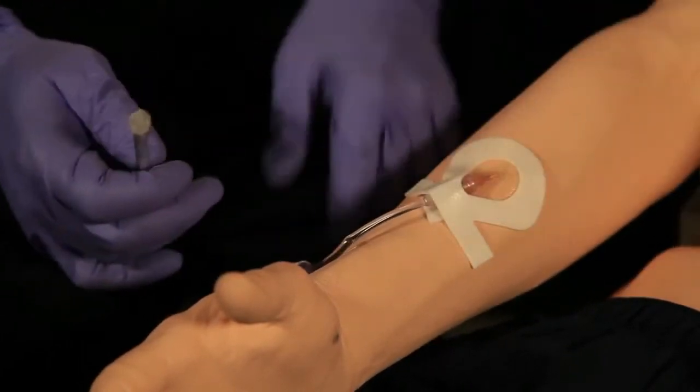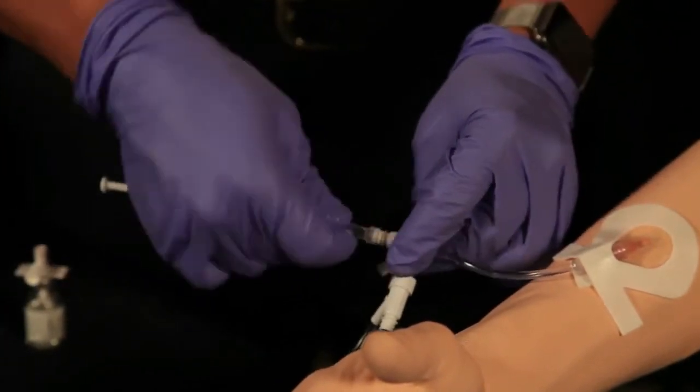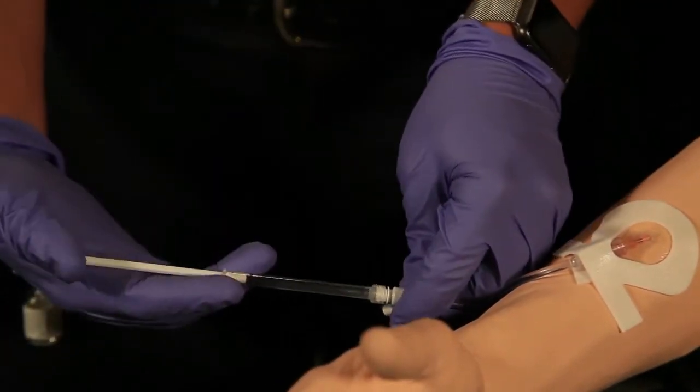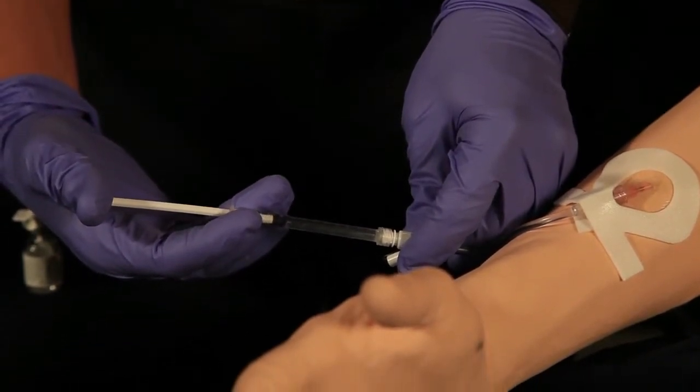As soon as this process is complete, we'll pinch off to our running line for administration. And once again, this is going to be a slow IV push, roughly over 1 to 2 minutes.